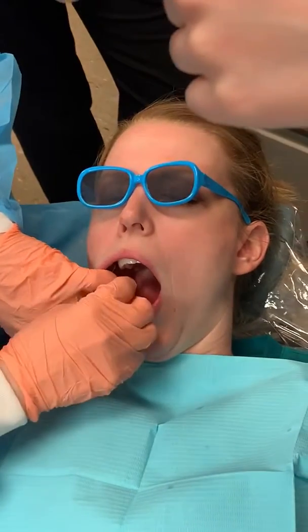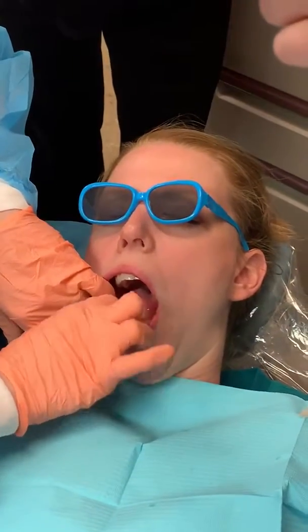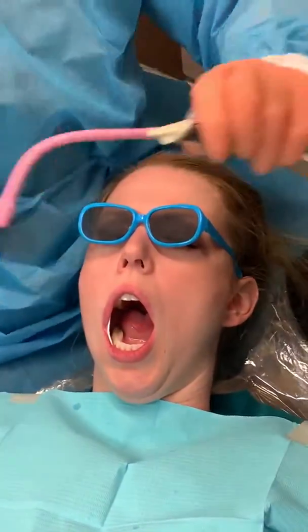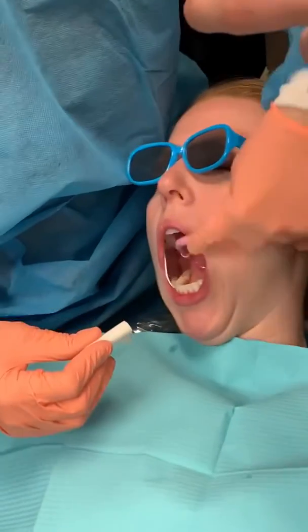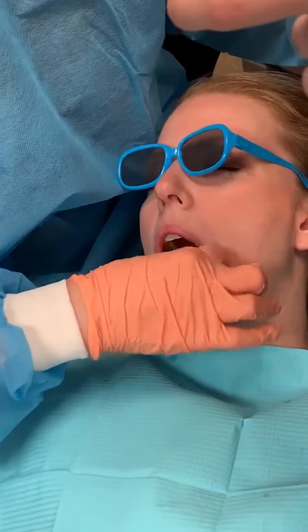And I'm going to stick a cotton roll on the outside of number 30. Just push it in there — don't be afraid to push it in there. You're not going to hurt them by pushing a cotton roll into their gingiva. Now I'm going to press them around just a bit and place the cotton roll by her tongue.